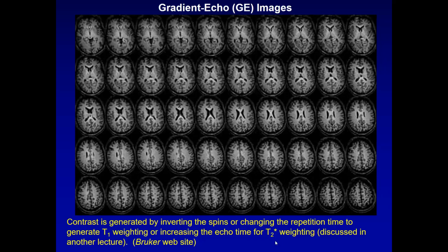And you can repeat that sequence I've shown you, run it very quickly through many slices, and you cover a large portion of the brain.